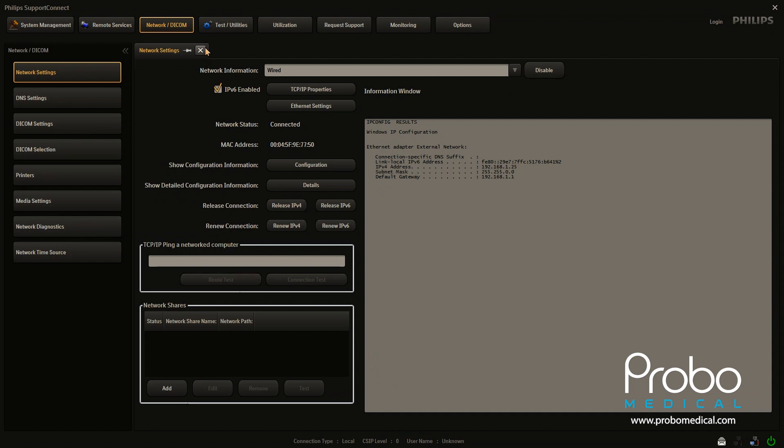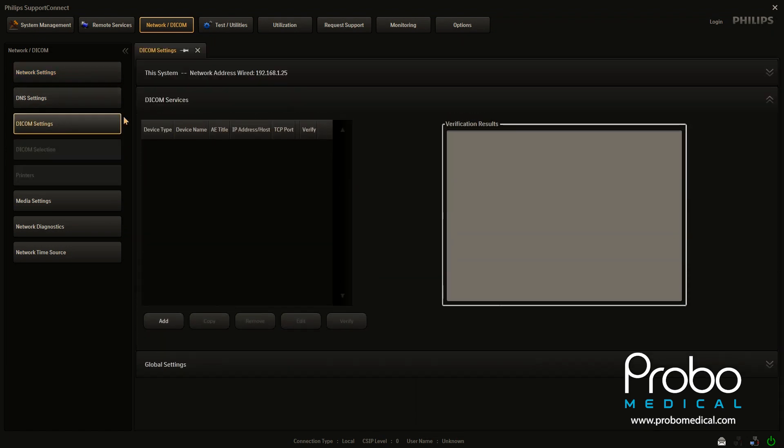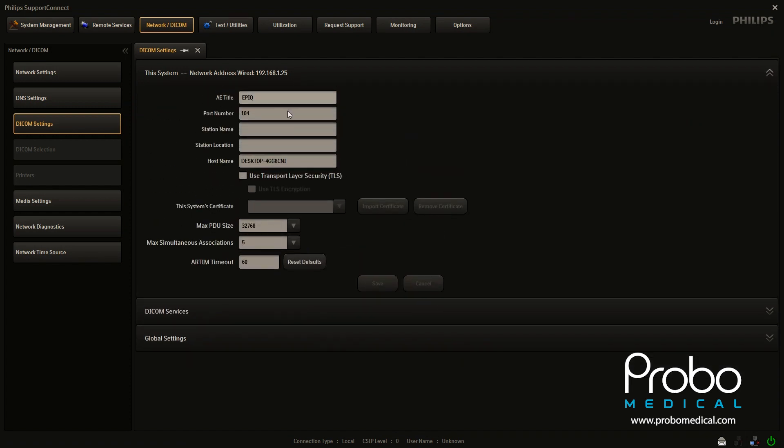So that will give your system an IP address and you're on the network. We're going to close this window now and we're going to move over here to DICOM settings. Just real quick, we're going to look at this particular unit.